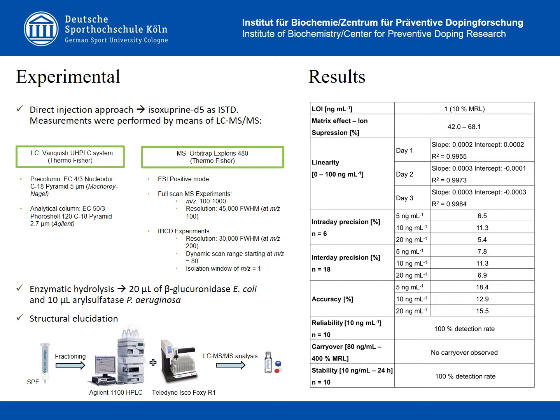And finally, for structural elucidation, solid phase extraction was performed, and then the obtained samples were fractionated on an Agilent HPLC system coupled to a fraction collector, and the subsequent LC-MS/MS analysis of these fractions was performed according to the same method again.